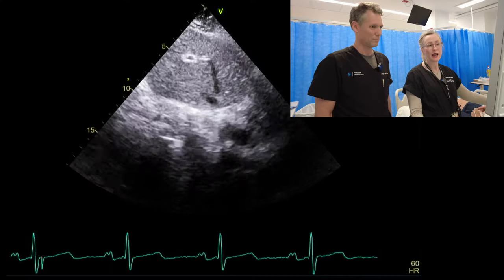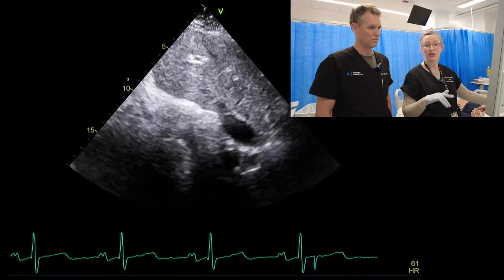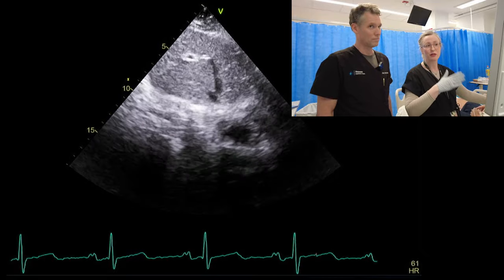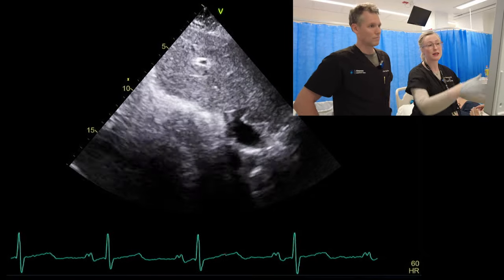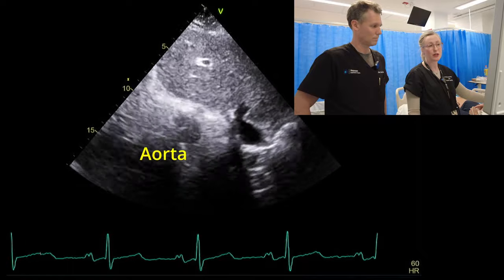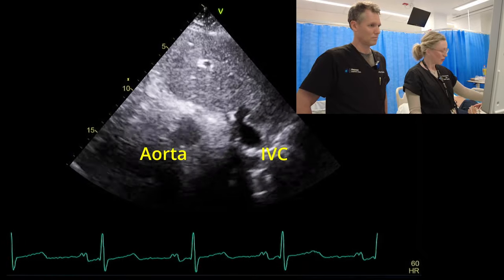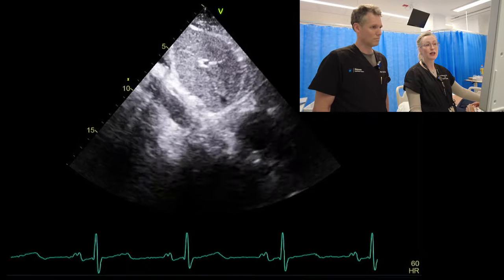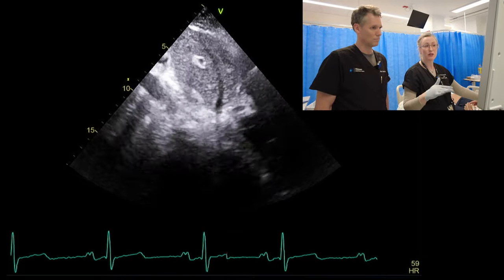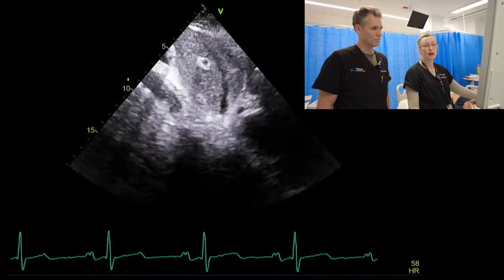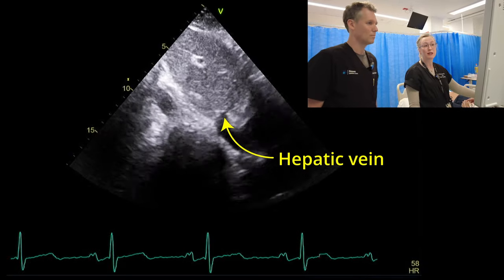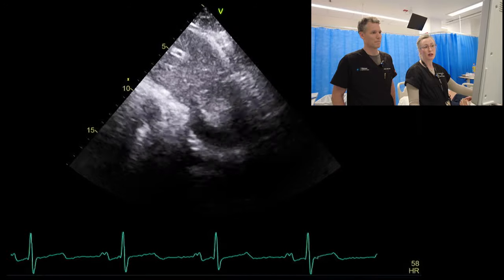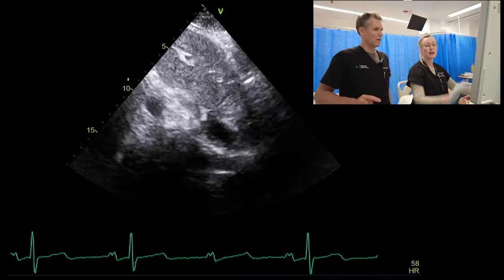Generally with any adult congenital heart, we start off in the subcostal and we want to check for situs — essentially making sure that the viscera are all on the correct side of the body. We've got the liver on the right side of the patient, and then the aorta and IVC next to that. We can fan through in short axis and essentially find that the IVC is draining into the right atrium and that the hepatic vein is connected to it. So fanning through and making sure you're happy with that anatomy going into the right atrium.